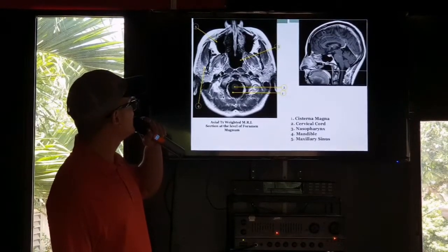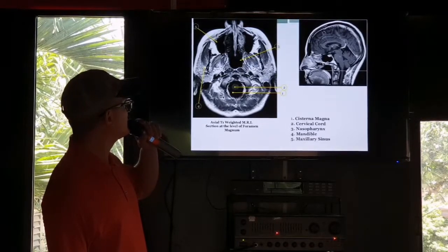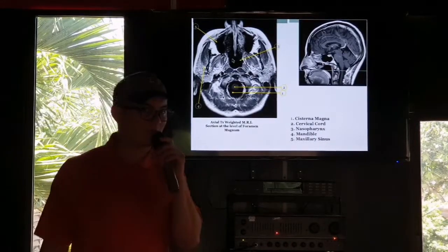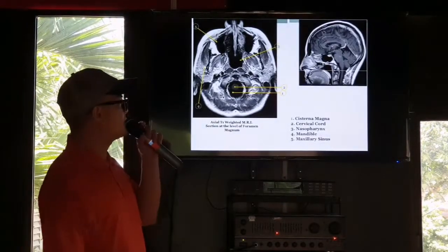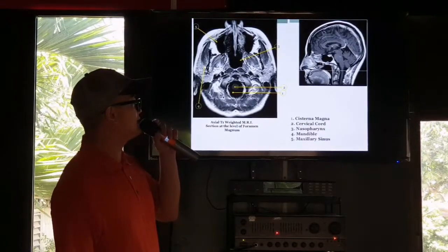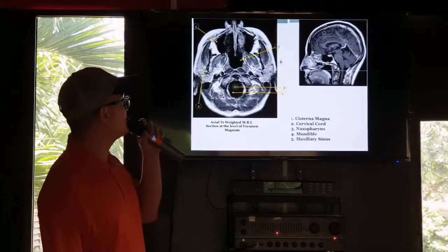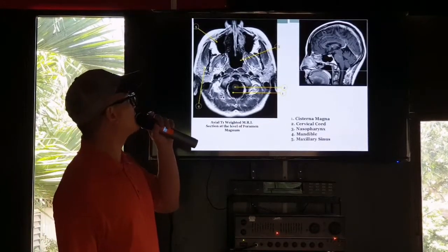nose. So you can see these are the maxillary sinuses. This is the nasopharynx. How do we know this is the nasopharynx? Because this is still so far down. Of course, if you do not have this image right here, on this image you can see that this is the nasopharynx because this is not the sphenoid sinus. But if you only have this image here, you can note this is still the nasal septum, so it's still so far down the nose.